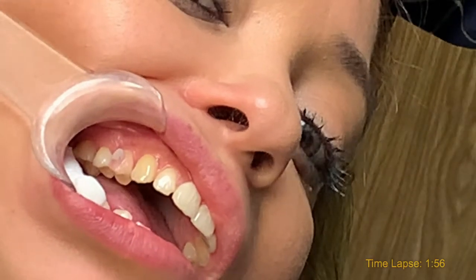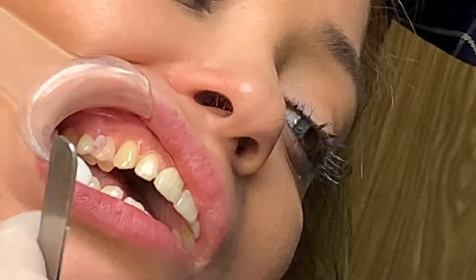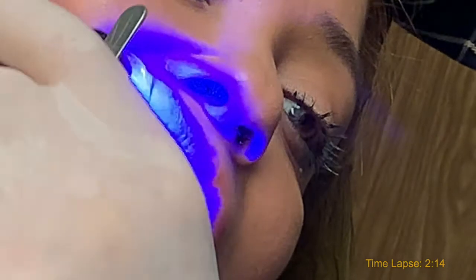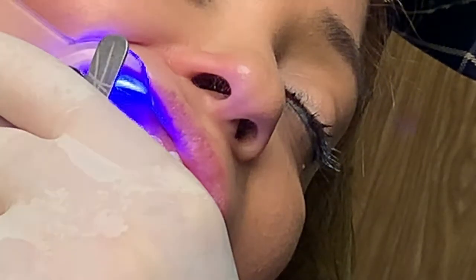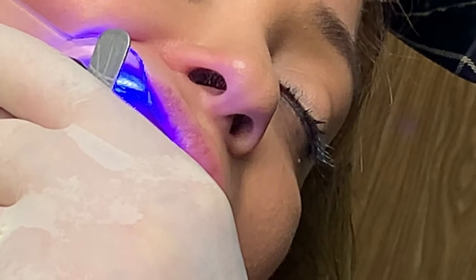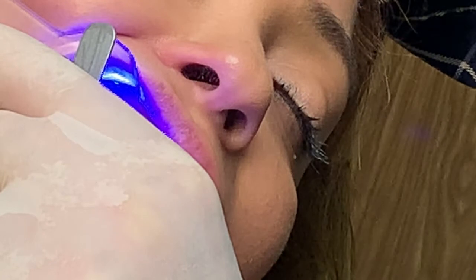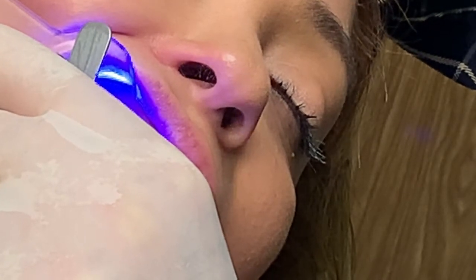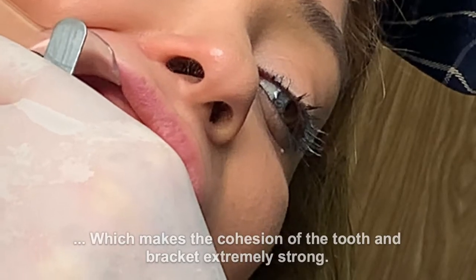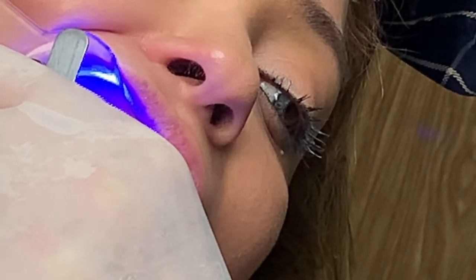Okay, we can tack that on. Turn your light on, tack. Okay, good. I'll help you. Once you tack it, it's good, we're ready to go. Prepare, don't put too much adhesive on it, okay? See, what's nice about these brackets, they're perfectly clear. So when you catalyze them, you know you're getting right to the bottom. Yeah, once it's tacked on, then I just bring it right down on it. Give it 10 seconds.